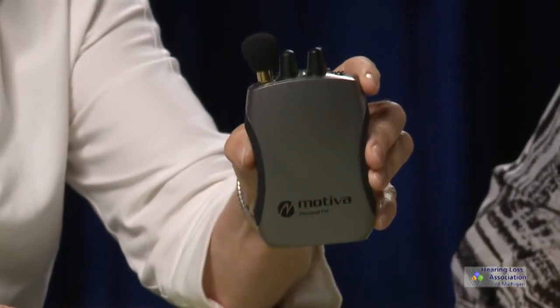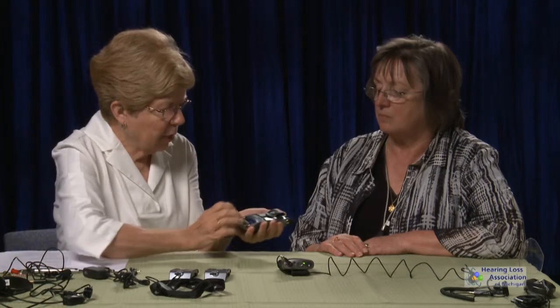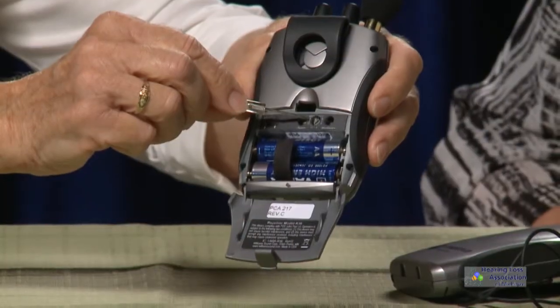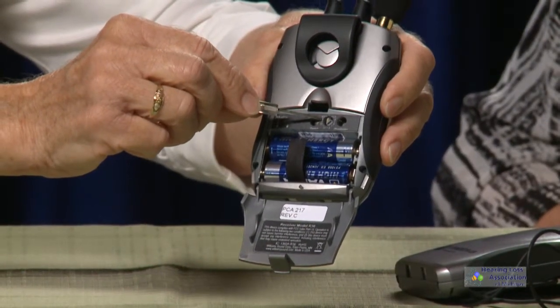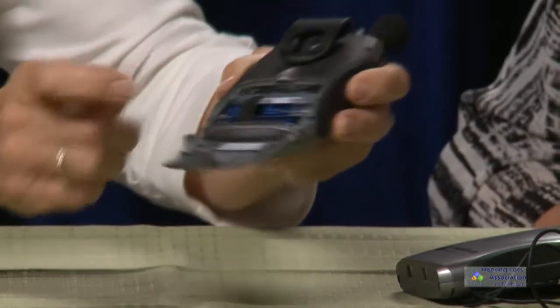Okay, this is the receiver. With the receiver, you're going to have to open up the battery cage, take a small little screwdriver, and go in here. It's a very tiny little space to make sure that it's on the same channel. So you could go from room to room, and as long as you know the channel they're using in each room, you could change the channel so that you could hear in that particular room.